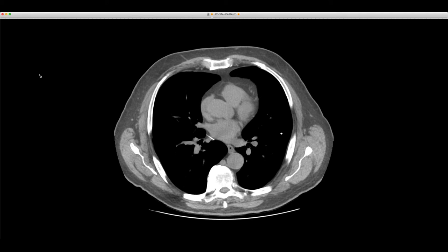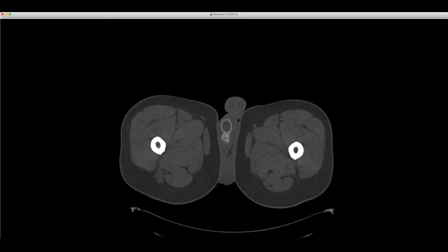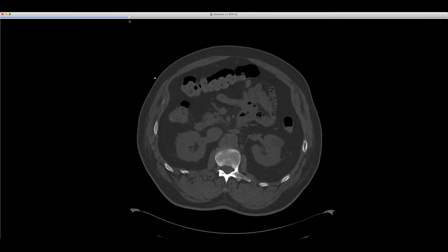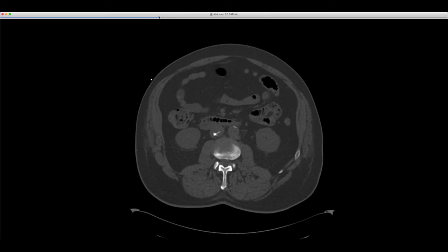Let me go back to an abdominal CT from a couple of years prior to this, and we'll take a look at it. Does it have a little bit of an L shape to it? Yes, it does. Let me make sure I'm showing this. Can you all see the abdominal CT? Yes, we do. Okay, and we can see this IVC filter.